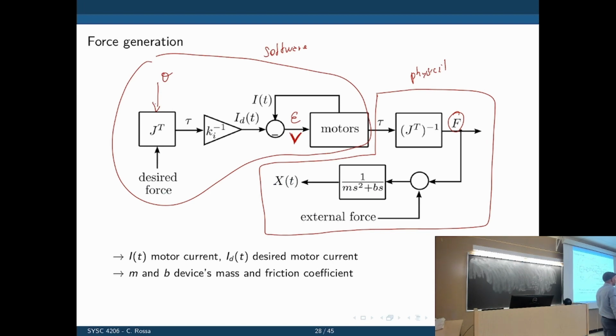You just mentioned the ID of T, which is the vector, has this current. So what we apply for the ID of T here is also the 3. Yeah. So this part here, if you have n motors, that would be times n. One controller per motor, one measurement of current per motor. Right? Combined, so then when you are combined, that tau on the other side is also a 3-dimensional vector, and then given to the structure through the transposed inverse Jacobian creates a force.